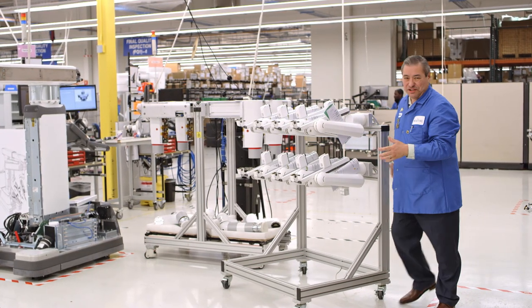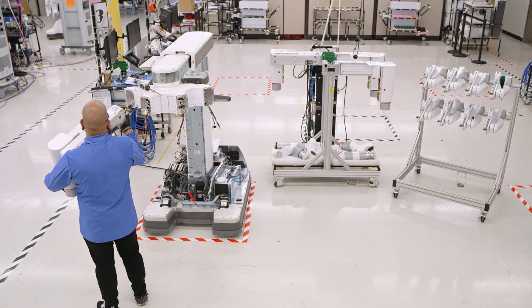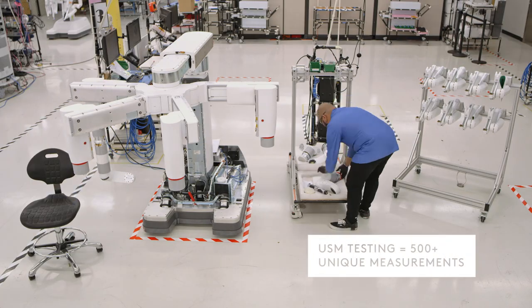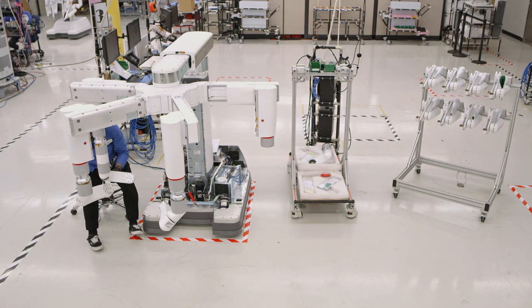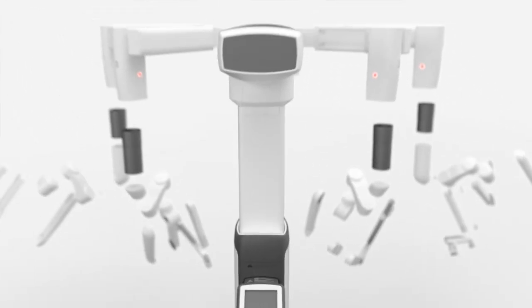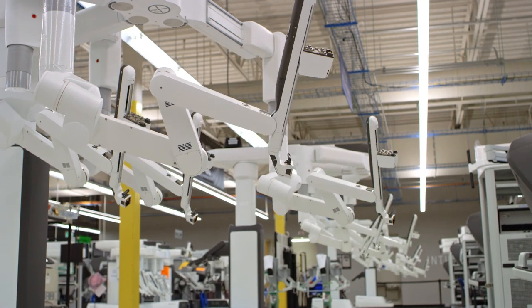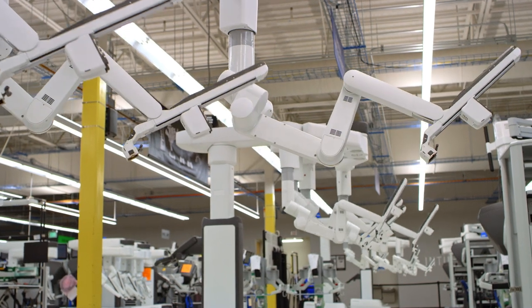This is where we finalize the assembly of the patient side cart. We're gonna mount onto the orientation platform the proximal distal arms and the patient clearance assembly of the setup joint. And then we'll mount onto it the universal surgical manipulators. The system will be functional once that's complete, and it's now ready to be tested. Since this is the first time that all these gears are put into motion, we want to give them sufficient time to wear in so that we ensure smooth motion and functionality of the system.